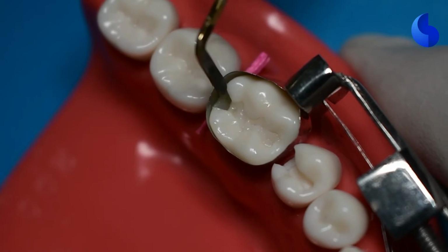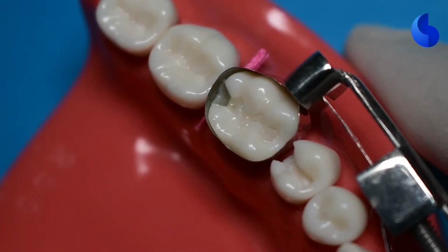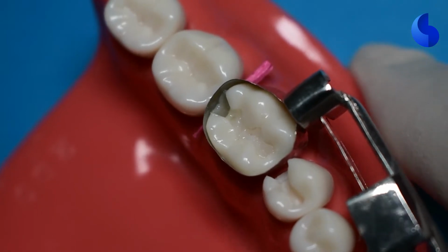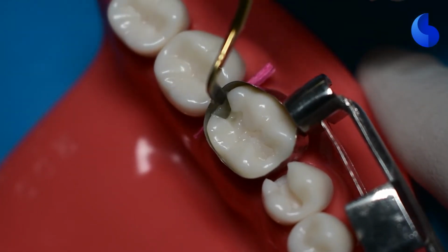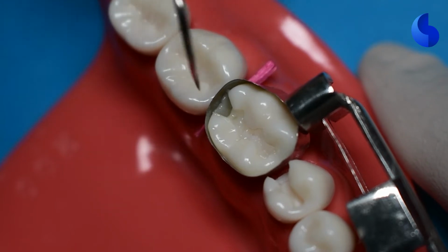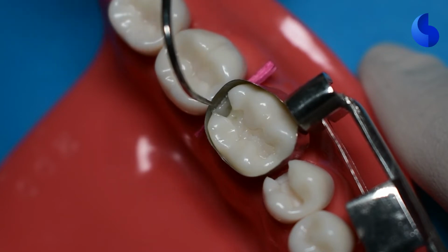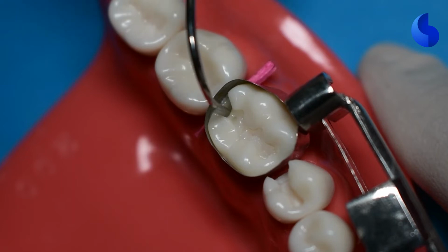Leaving a void in a restoration is a critical failure, and the time that it takes to correct a void is much greater than filling this restoration itself. So spend some additional time to ensure that your material has completely condensed all the way to the cervical area by placing apical pressure using a condensing instrument or a plastic instrument.